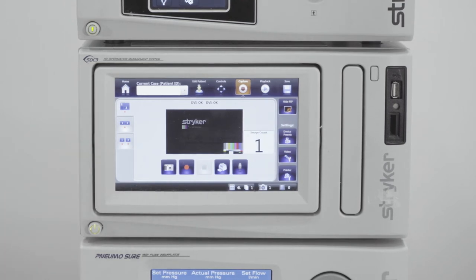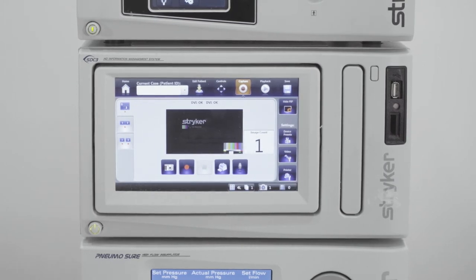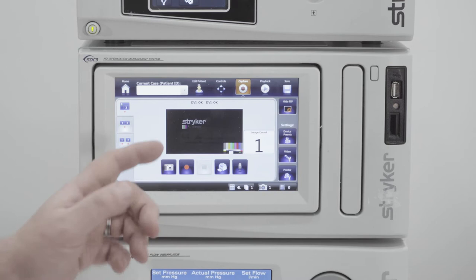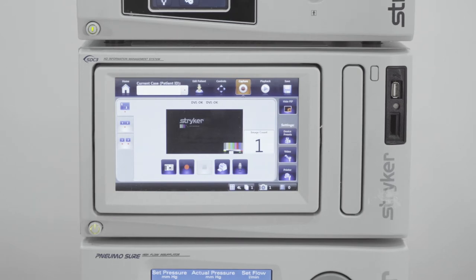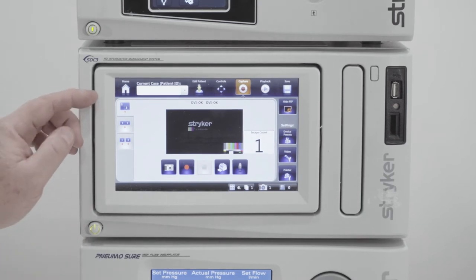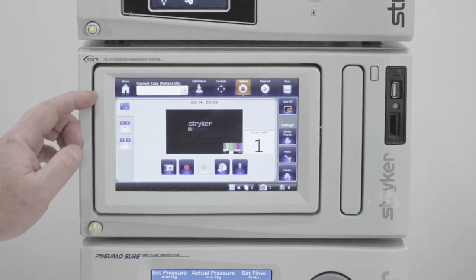The screen in dual channel mode looks a little different from single channel mode. In dual channel mode you have three options. The first is picture-in-picture. Right now we have a Storz CCU in the second channel and the Stryker 1588 in the primary channel — displayed as P for primary and S for secondary in your video album.